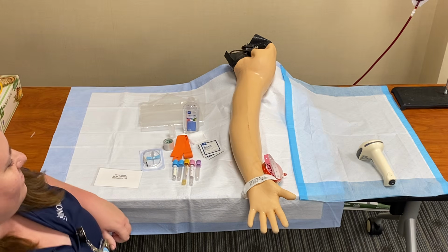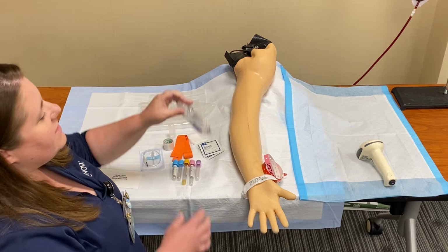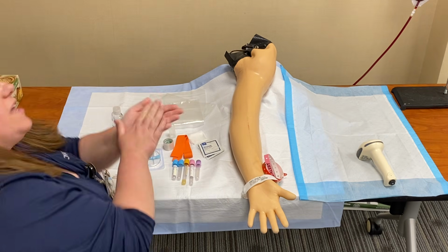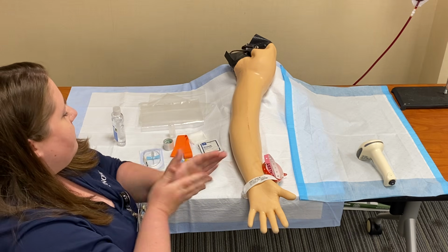Come in. Hi, I'm gonna do AID. My name is Teresa, I am your clin tech. I am here to draw some blood to send to the lab for some tests. It'll take about 10 to 15 minutes. Is now a good time?